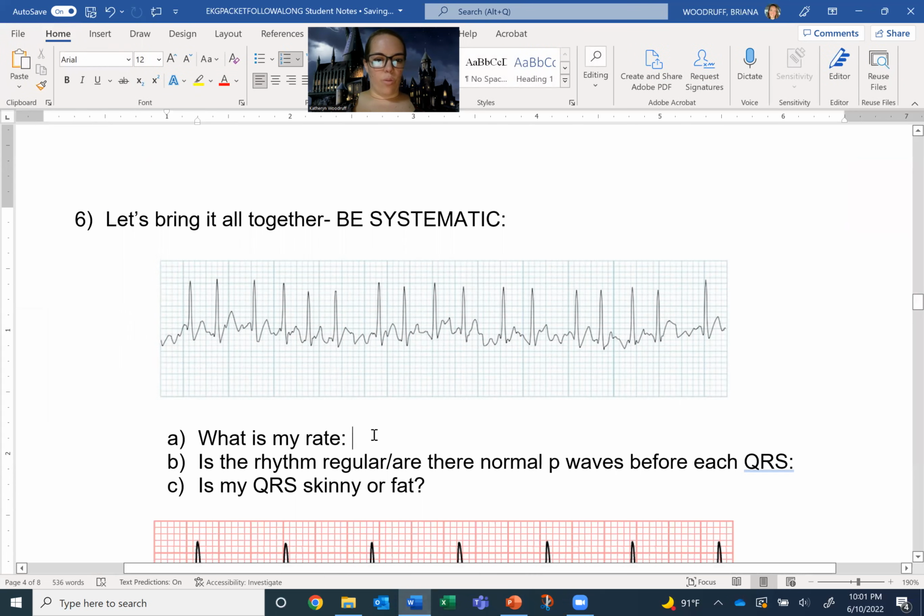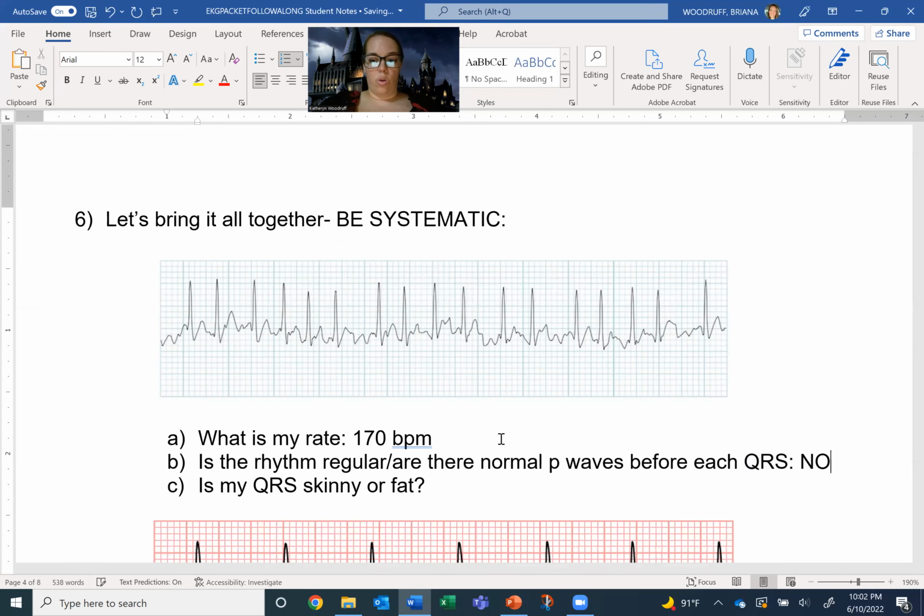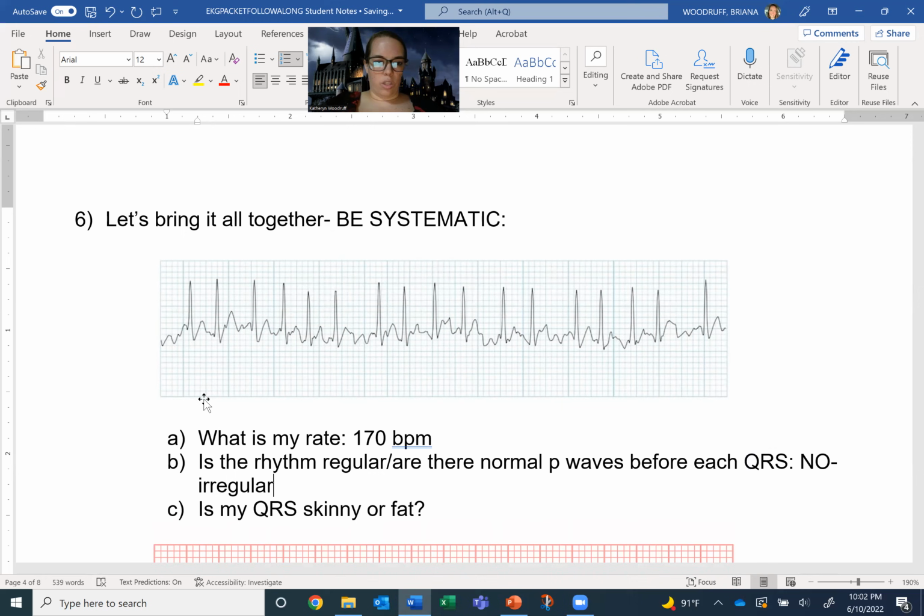Alrighty, so what is my rate here? Let's count. So we always start with the rate. 1, 2, 3, 4, 5, 6, 7, 8, 9, 10, 11, 12, 13, 14, 15, 16, 17. I am 17 times 10, which is 170. Is my rhythm regular? No, it's irregular, because you look at the distance in between all of these.